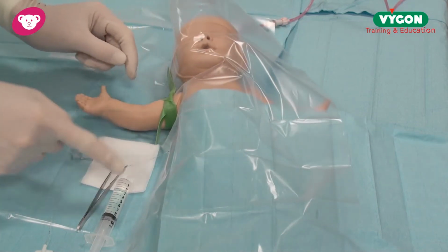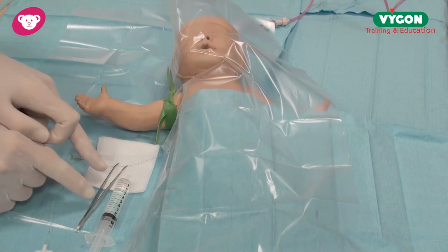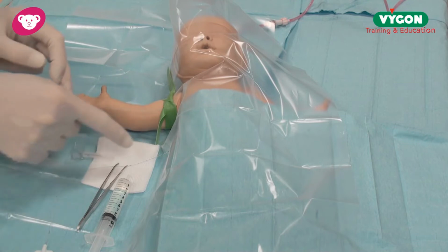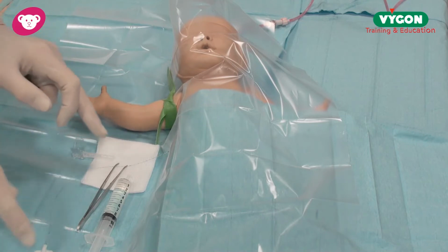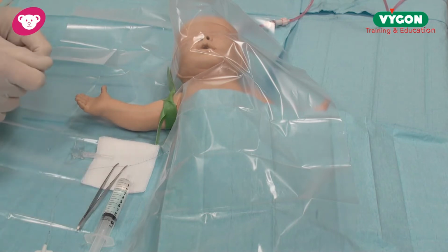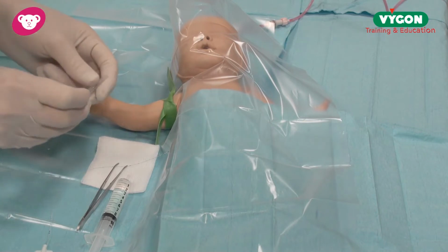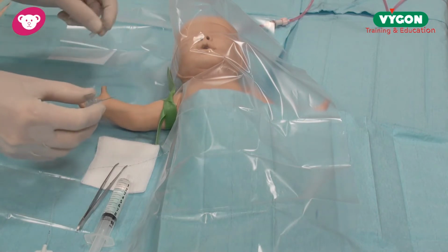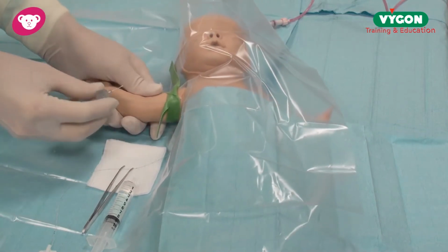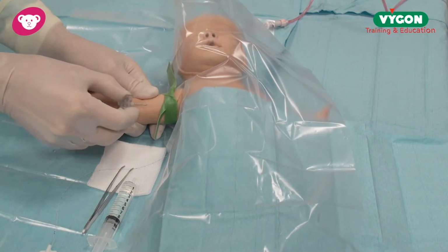I have all my materials ready: my breakable needle, curved forceps, non-toothed, and the catheter. In this case it's the 1 French Premicath with a stylet in place. I have my syringe with normal saline ready for any flushing that I may need while I place the catheter. I take the shield off of the needle, dispose of that, hold the baby's arm, and now I want to cannulate the baby's vein like so.